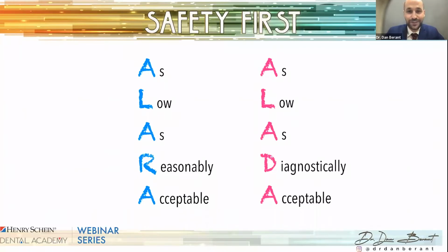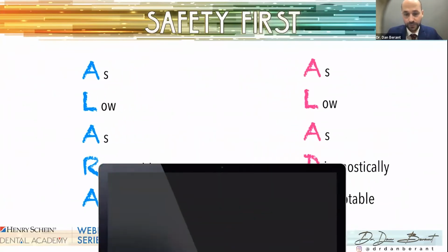Now, in terms of what we always learned in dental schools, the ALARA principle, trying to utilize radiation as infrequently as possible. And in 2013, the American Academy of Oral and Maxillofacial Radiology came up with ALADA, which is to encourage us to use the technology available, but as low as diagnostically acceptable. And so if you have a two-dimensional option that's emitting less radiation and still allowing you to diagnose it, then that would be favorable over unnecessarily radiating someone with a cone beam CT.